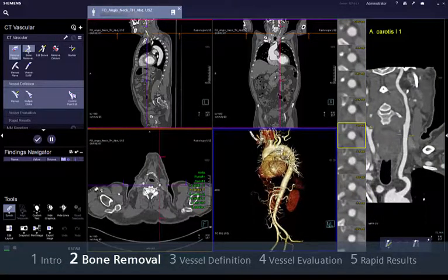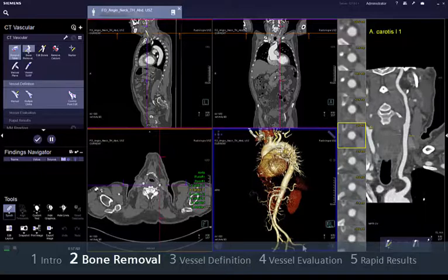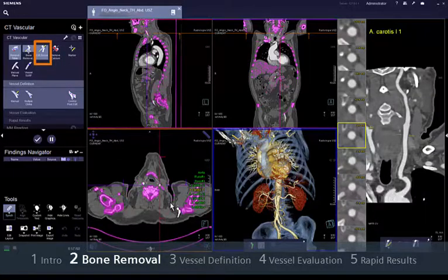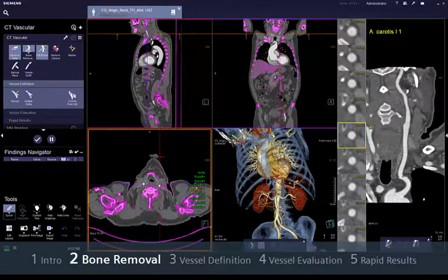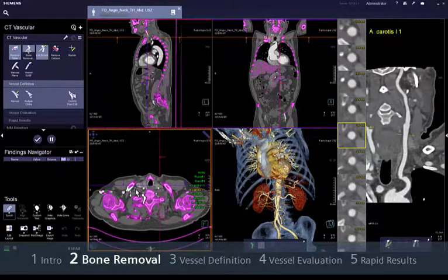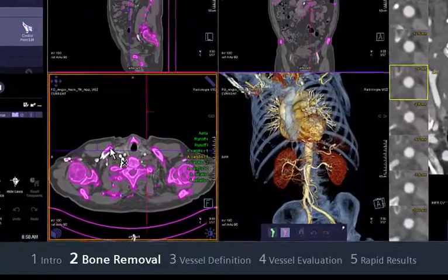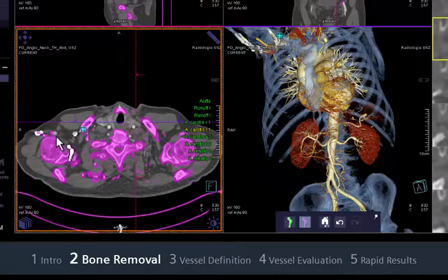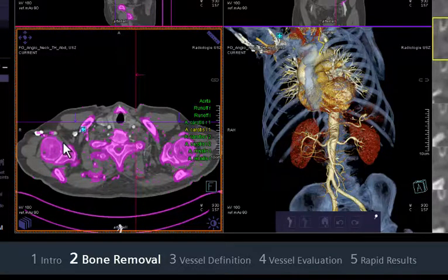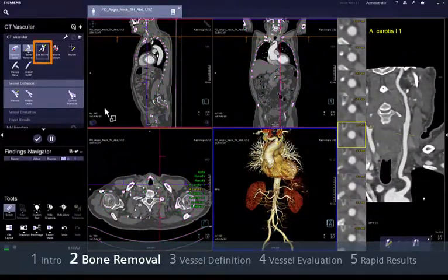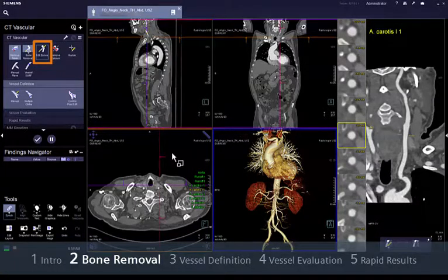Depending on the body region and the type of dataset, Syngovia will automatically choose between different algorithms to mask out bones. You can optimise the automatic bone removal manually by activating the Edit Bones option, then clicking on any area that you want to include in or remove from the mask. The cursor changes when you are on a region that can be added or excluded. The mask is updated accordingly. To finish editing and update the bone removal results, simply deactivate the Edit Bones icon.